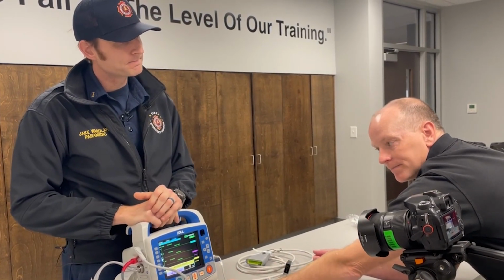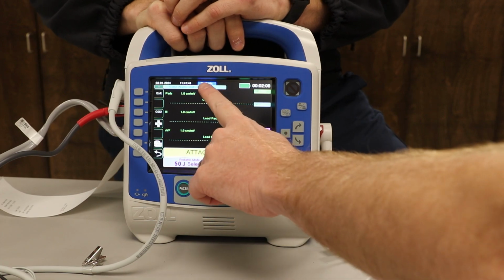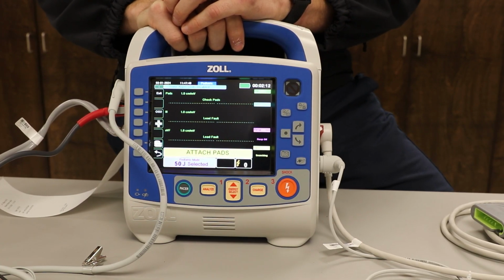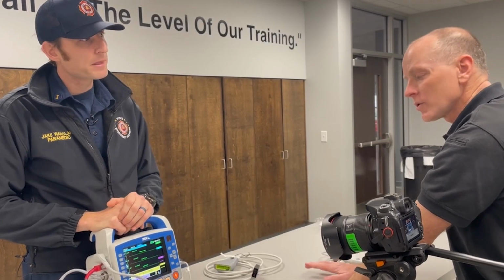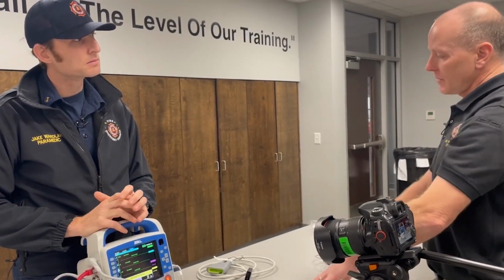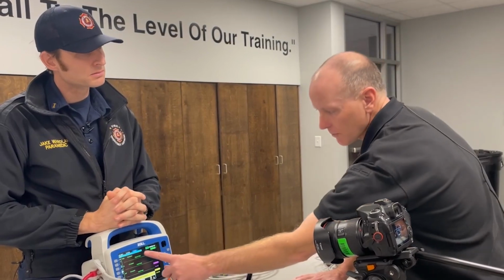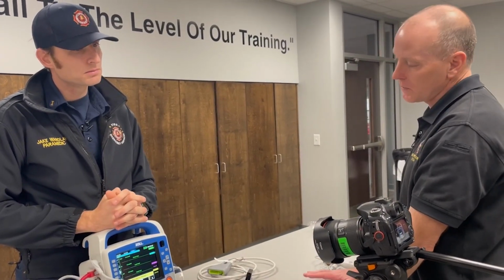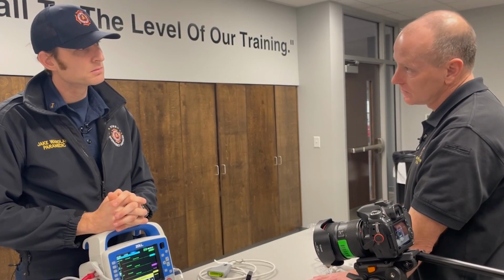And once again, we need to make sure we're consciously putting that into pediatric mode if we're doing an anterior lateral placement. If we're doing anterior posterior, it should be fine. You still want to try your best to remember to come back and put that down. Try to always remember to put your AED into pediatric mode.